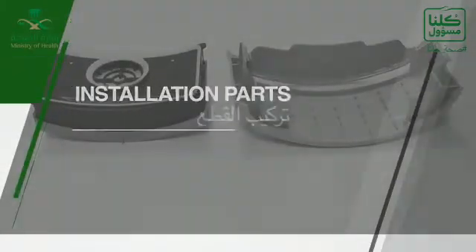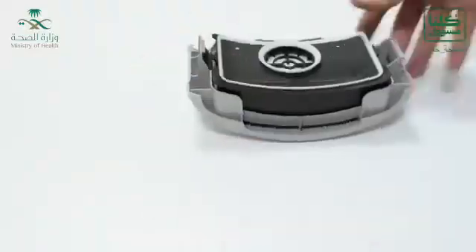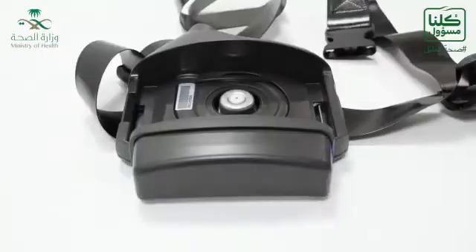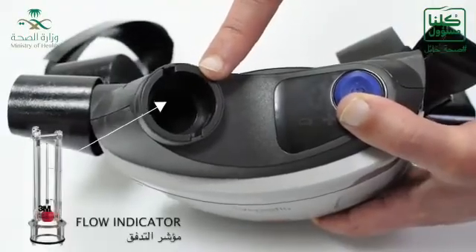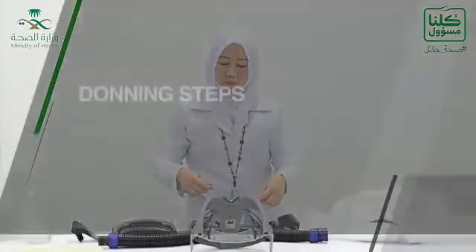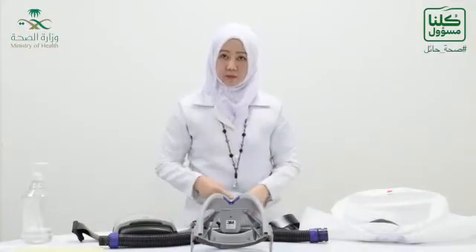Now, how to install the parts. This is how you install the filter and the cover. You have to test the battery before use, then install the battery in the device. Then apply the filter. This is the area where you apply the flow indicator, and these are the two parts of the breathing tube. You can adjust the head suspension according to your head size, as you can see here.